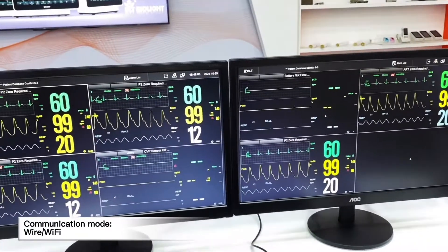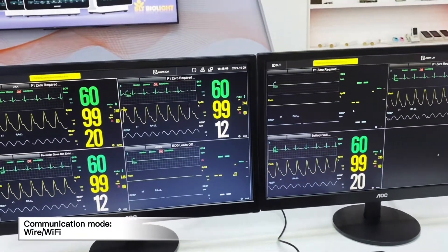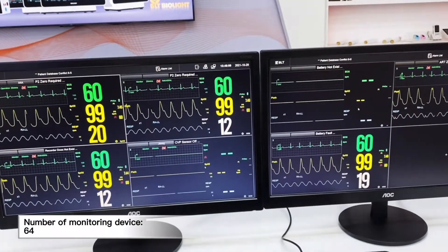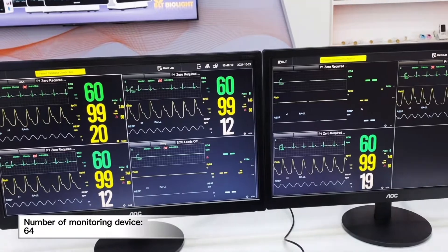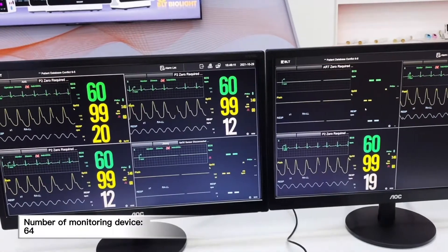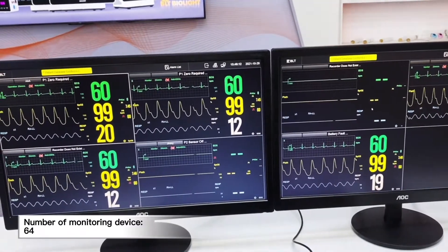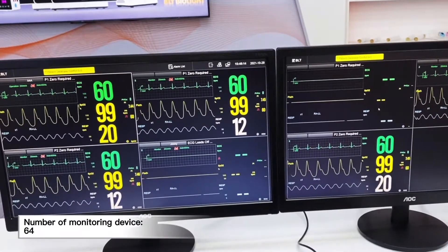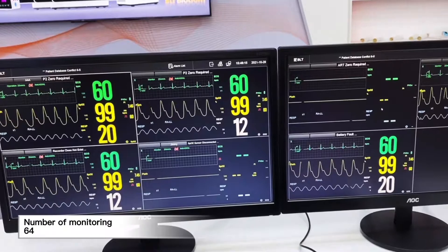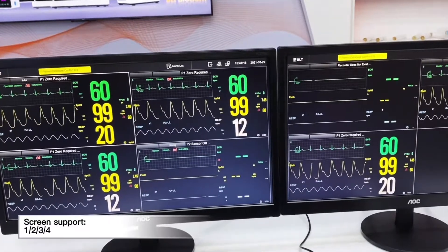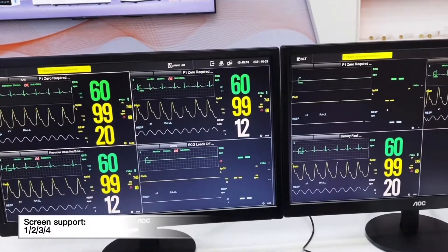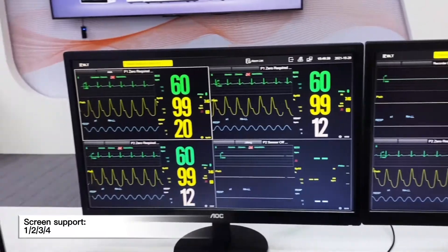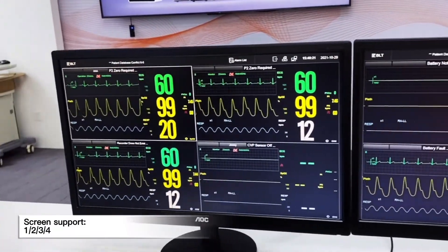The communication modes include wired and Wi-Fi. The number of monitoring devices supported is up to 64 devices being monitored at the same time. Screen support includes one screen, dual screen, three screen, and four screen.